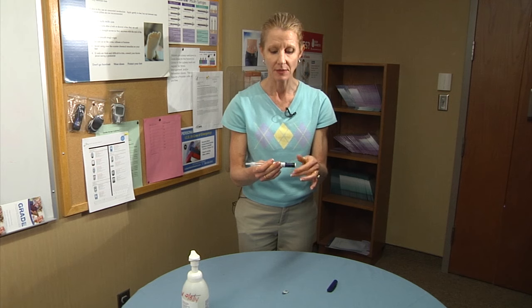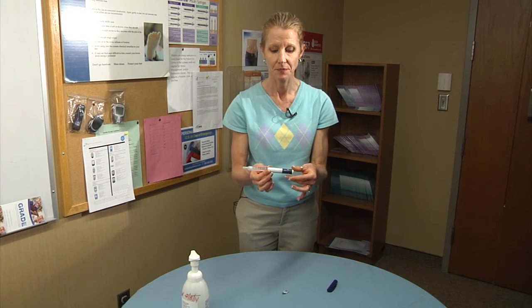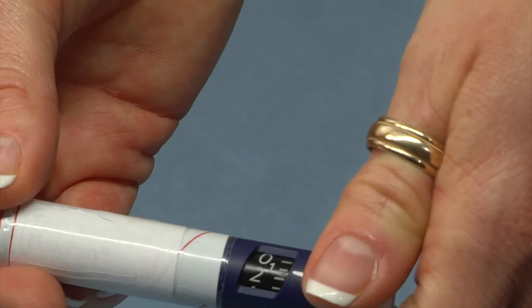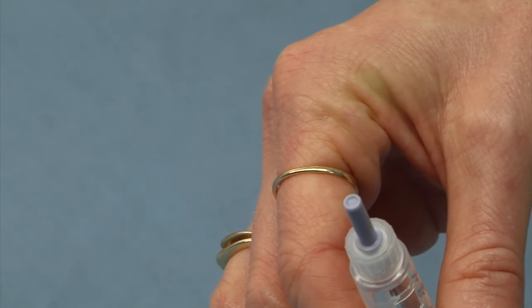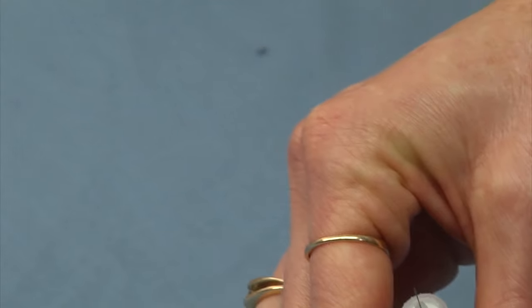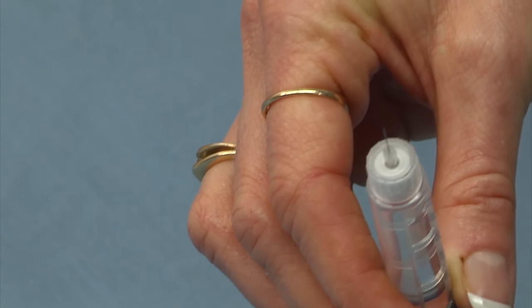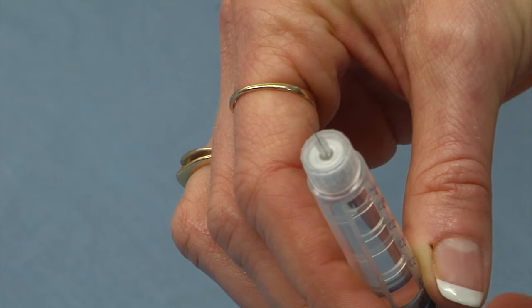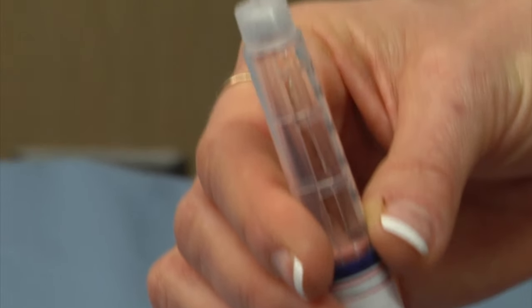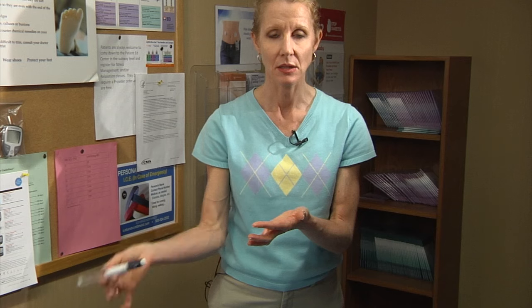Next you want to do what we call a safety check to make sure there's no air in the system. Dial the dose indicator to two units. Remove the outer needle cap and save that for later. The inner needle cap you can remove and throw away. Push on the injector button and watch the end of the needle to make sure you see some insulin come out — it might be a stream or just drops. As long as you see liquid, you know there's no air in the system.